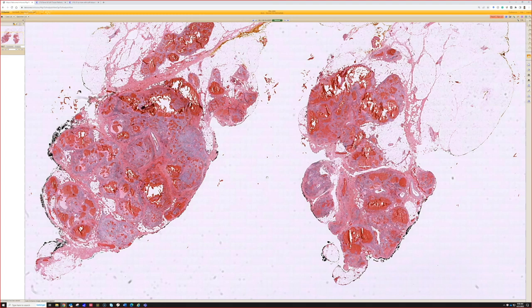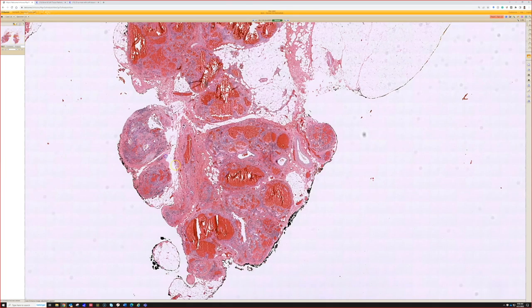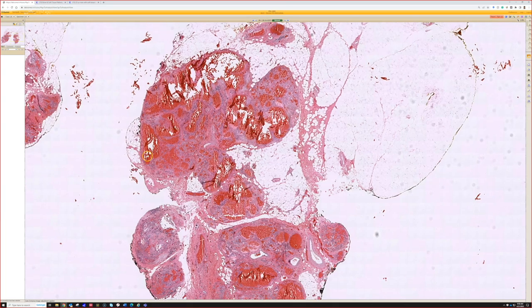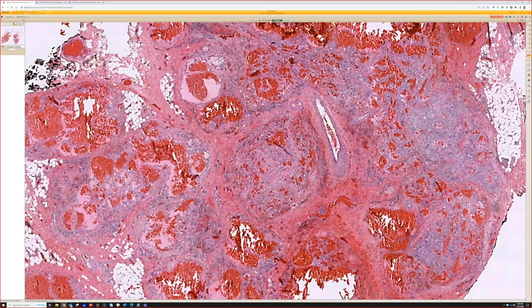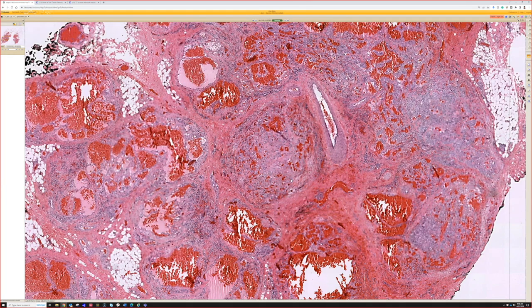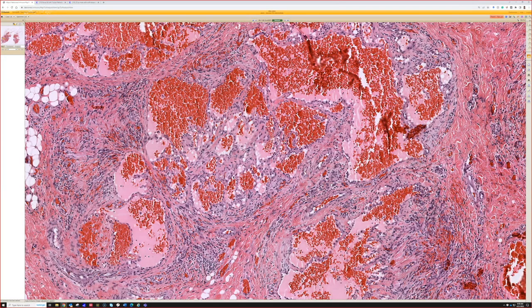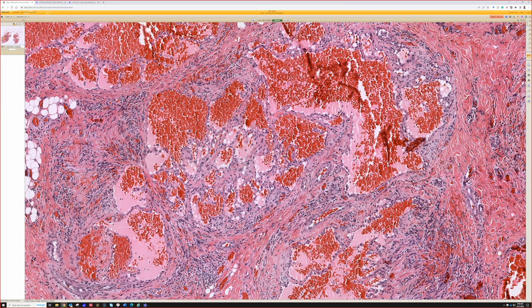In the deep subcutis, there's a multi-nodular proliferation of what looks like endothelial cells with some blood spaces that are dilated. There's also a background cellularity of spindle cells. There are some cavernous spaces — we see blood and serum in these dilated areas. 'Cavernous' just means big open spaces, often with thin walls, like a cave or cavern.